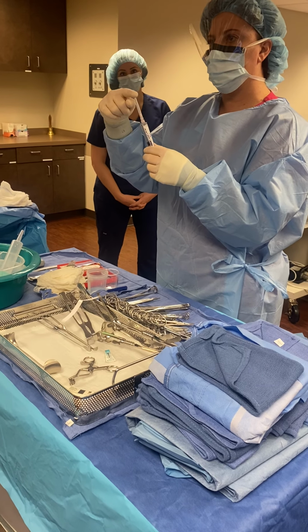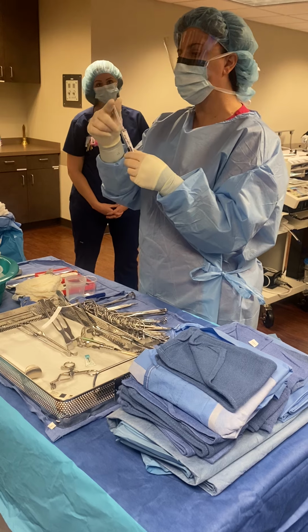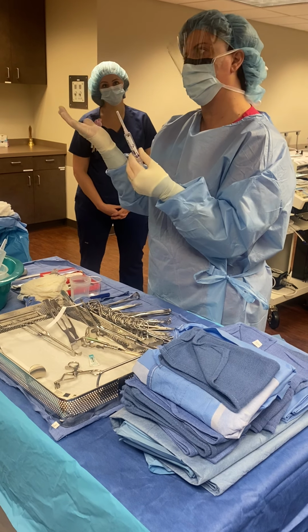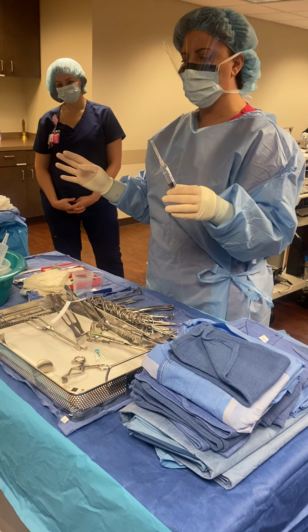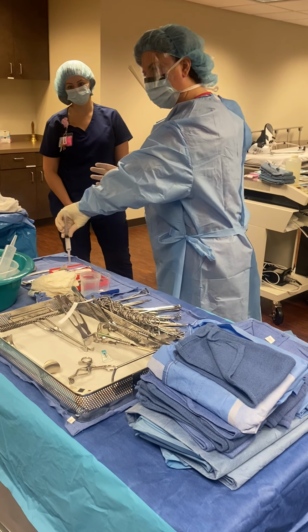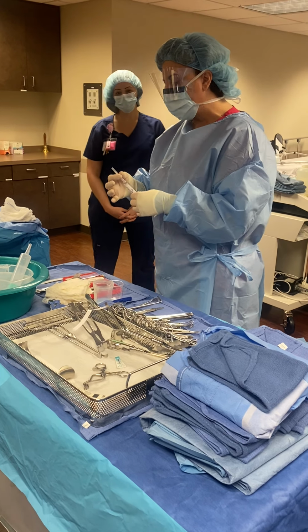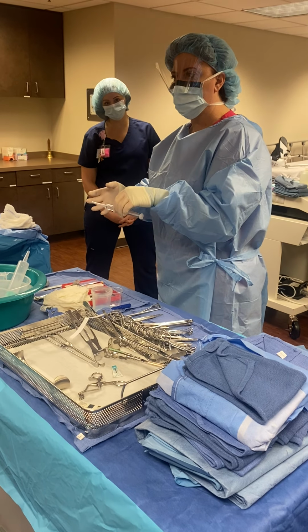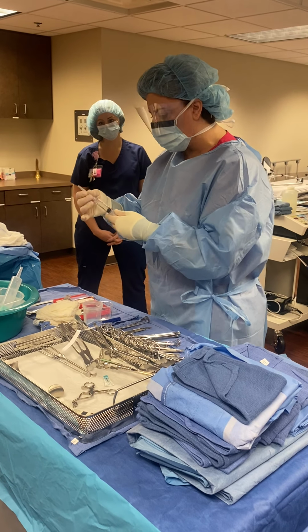I would refrain from doing this, what not to do, what to do. If the integrity of the cap isn't good, you don't want to hurt yourself. Don't even open up that door. Some people will scoop it and push it on like this. Again, it's probably okay, but if the integrity of the cap isn't good, it could poke through. Anyways, this is the practice I use, but it's not the only practice.